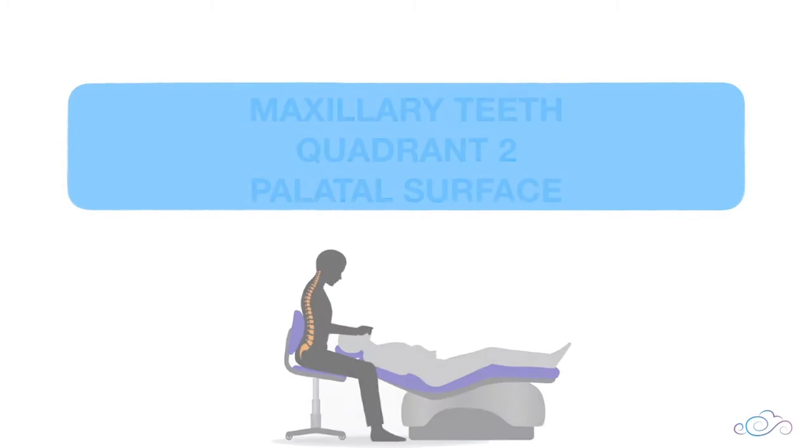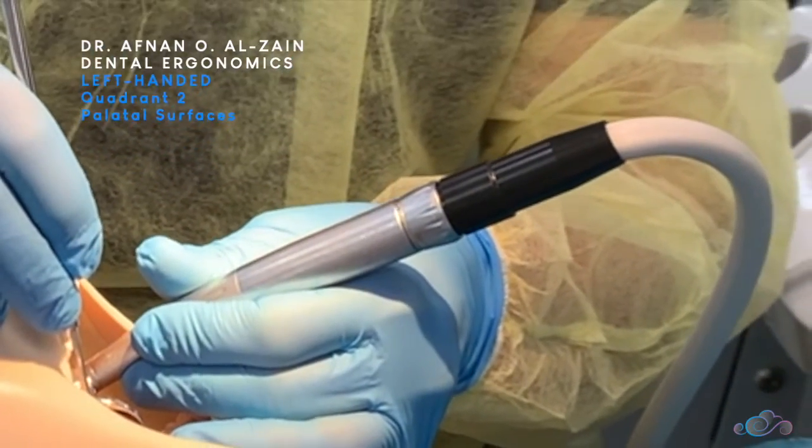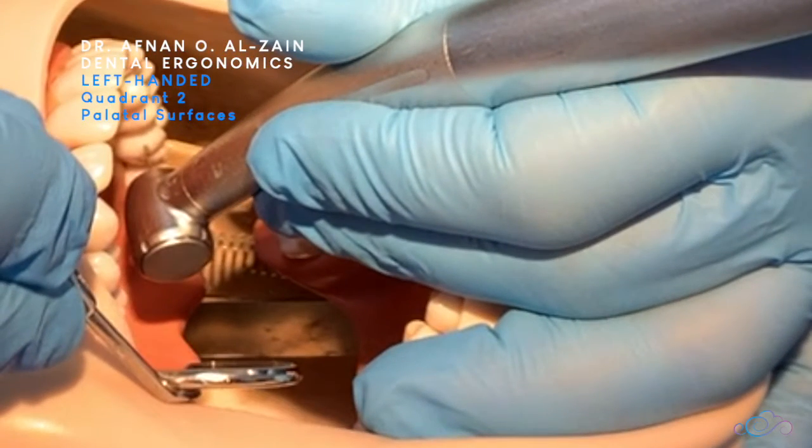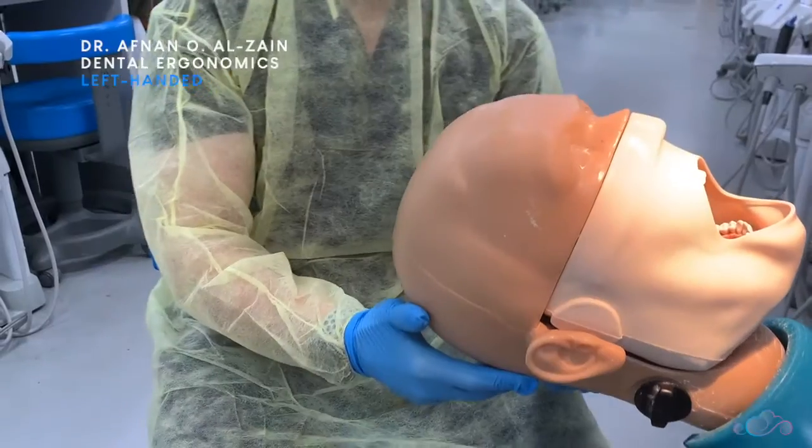Moving on to the palatal surfaces of quadrant two. You're going to sit on the left side of the patient or left rear, then place finger support, place the burr perpendicular to the surface, and look indirectly through the mirror.